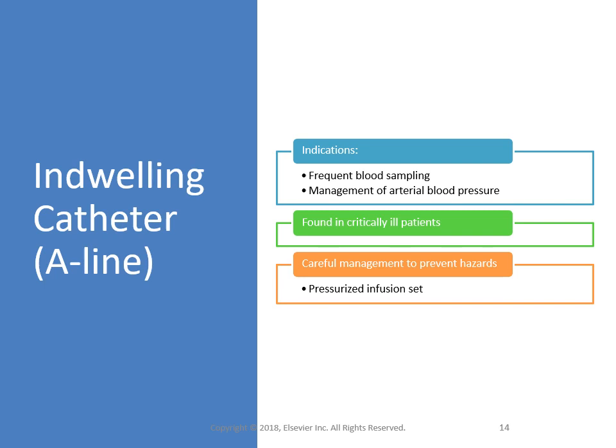Let's talk a little bit about indwelling catheters or art lines, A-lines. Arterial puncture causes trauma, and so an indwelling arterial catheter or A-line should be used when frequent sampling is necessary, like a long-time ventilated patient. As a result of potential hazards of hemorrhage and bloodstream infection, A-lines require careful management, and their use generally is limited to very unstable patients in the intensive care unit.